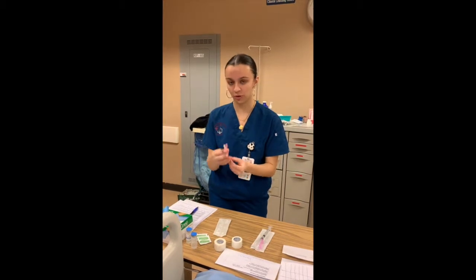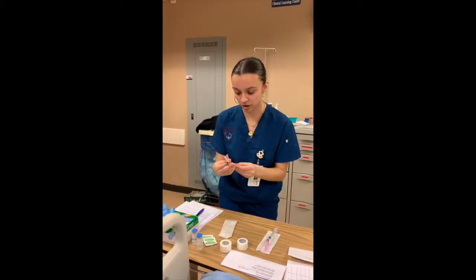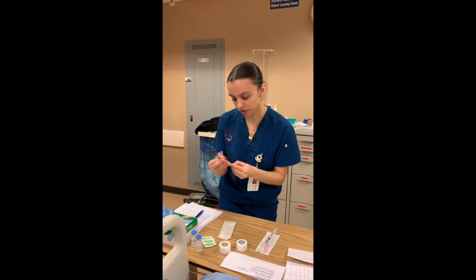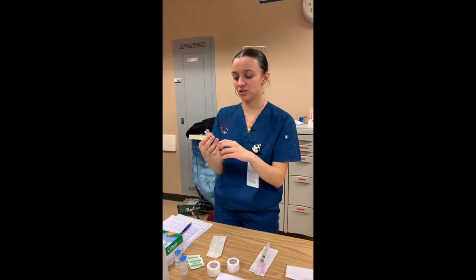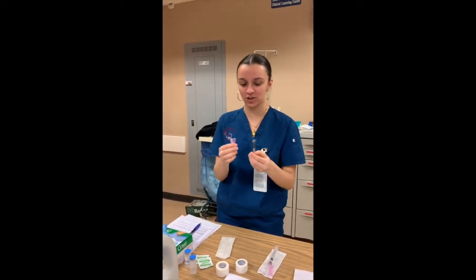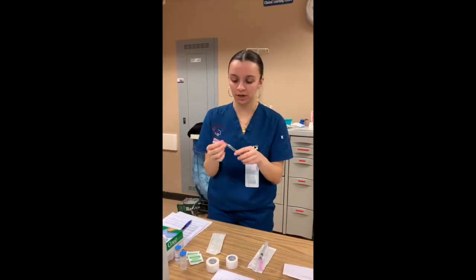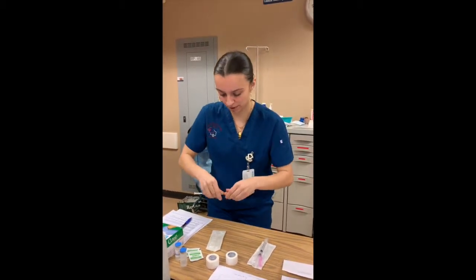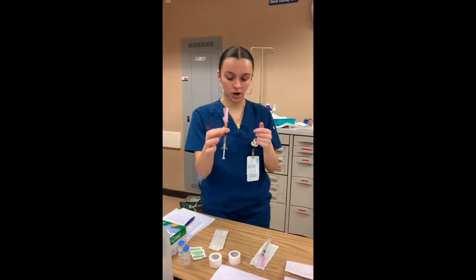So I'm just going to put 0.5 milliliters of air so that I can inject that into the medication. So now I've just inserted 0.5 milliliters of air. Now I'm just going to put the needle with the cap on it so that I can prepare that. So just a twist on there. And then now it's fully on.